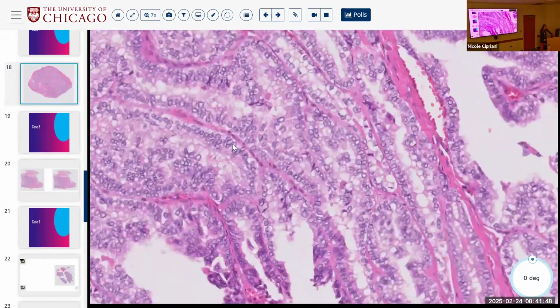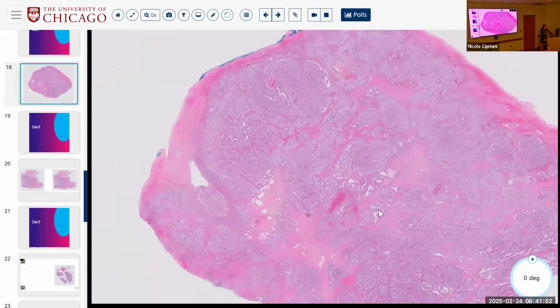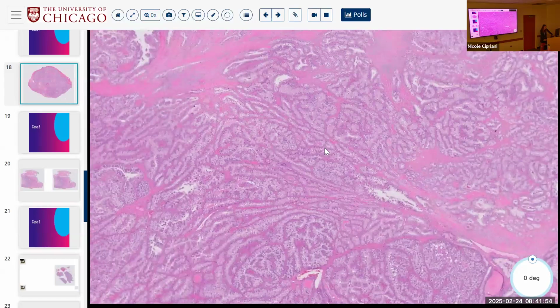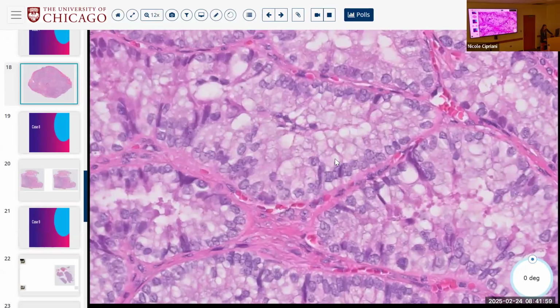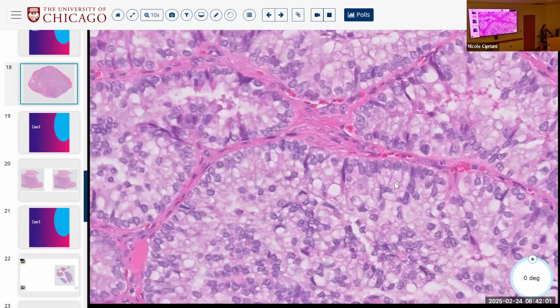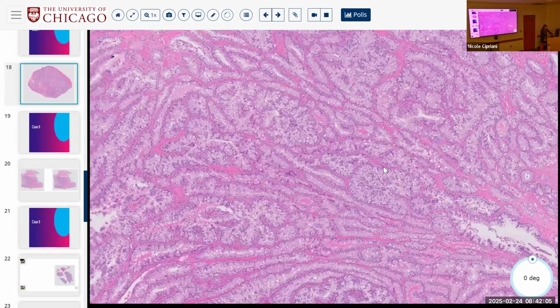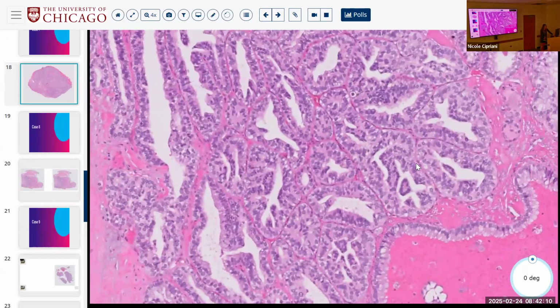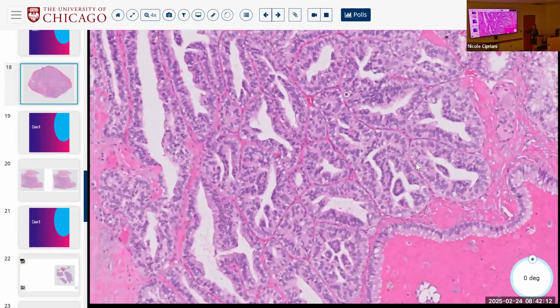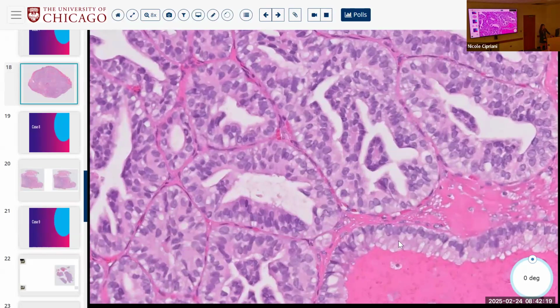Tall cell? Is it very pink? Is the cytoplasm very pink? No, the cytoplasm is very pale, right? Columnar cell. This is columnar cell with the cytoplasmic vacuoles, right? So if you didn't know this was thyroid, I might look at this and be like, is this endometrial carcinoma, right? It's very blue, it's got these elongated nuclei with sub or supranuclear vacuoles right here, right?